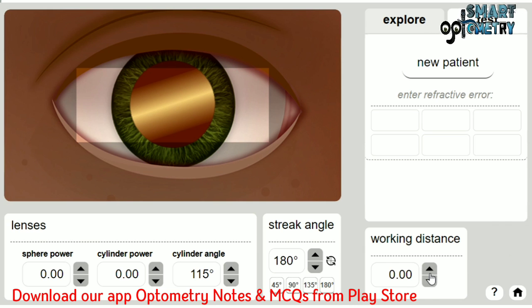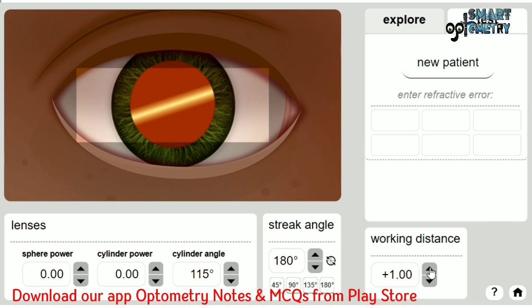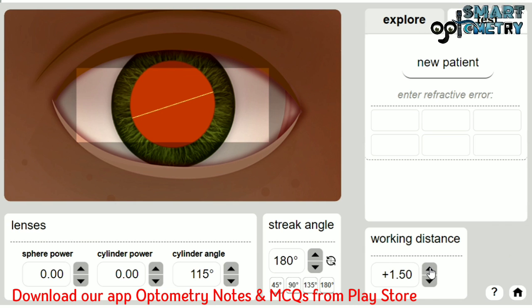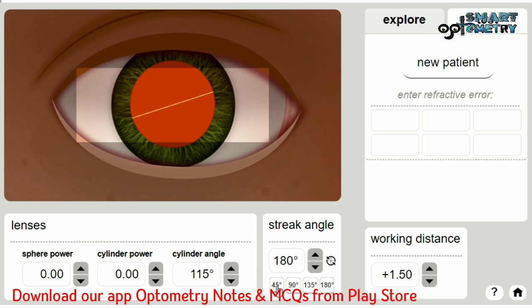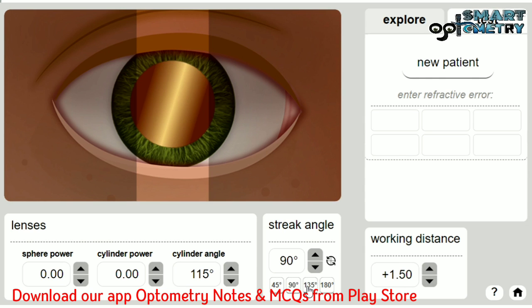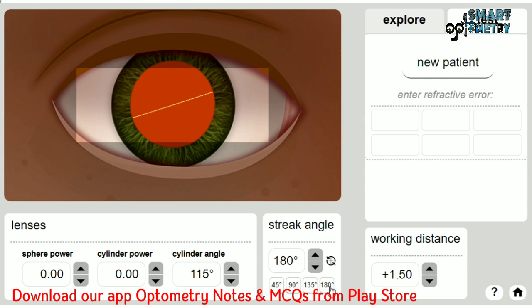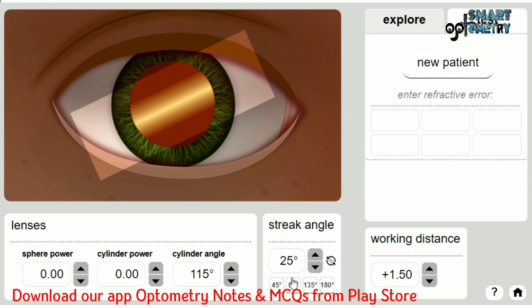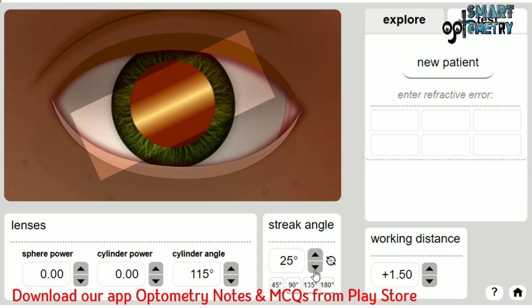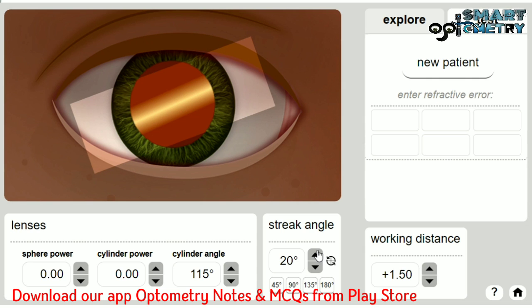You have to place your working distance power here — that is normally 1.5 diopters, but you can use any working distance you prefer. Here you can choose the angle of your retinoscopy streak to find the principal meridian. Click the top button to increase the axis and the bottom button to decrease the axis.